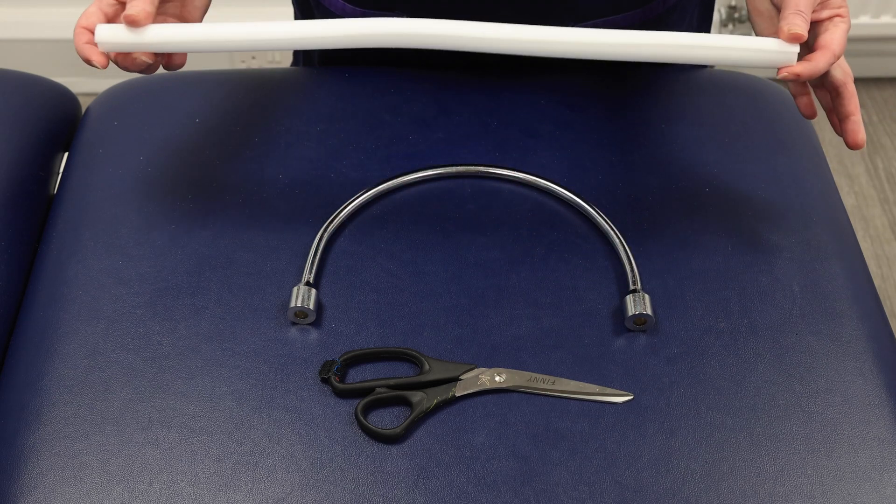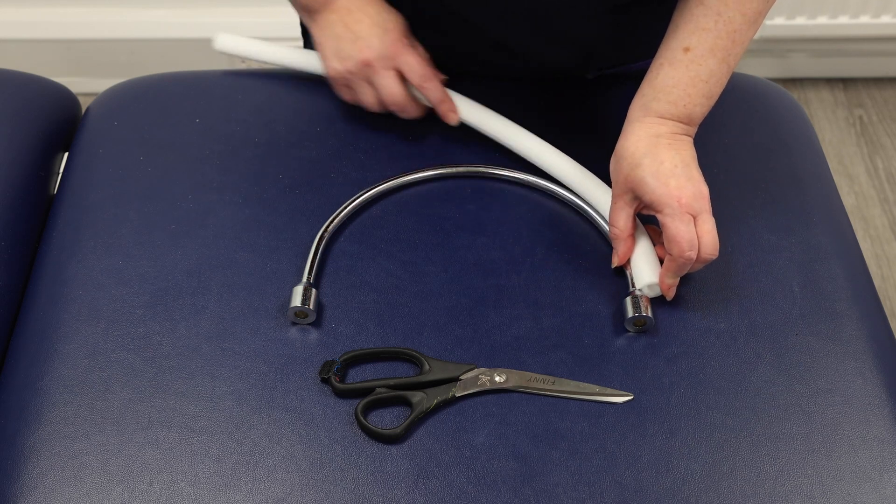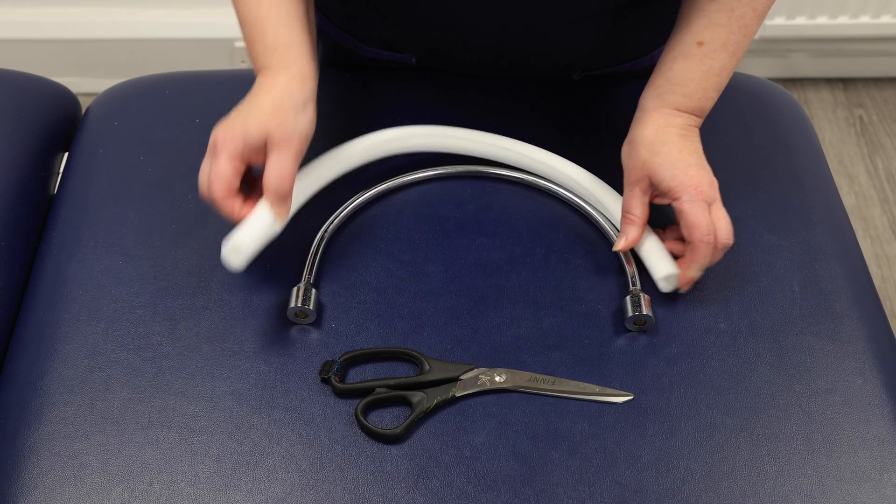Now take the size 2 hoop ring and fit the padding tube, trimming it as needed.